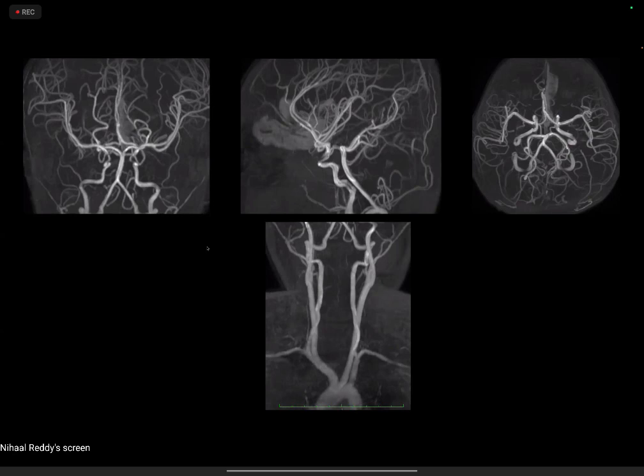Yeah, sure. But the ischemia and hemorrhage is pretty evident. It is causing pressure effect and resulting in ischemia to the extra-axial hemorrhage. So we'll have to look at the pituitary and stuff. Maybe you can send in the images or the entire scan. Yeah, I'll.